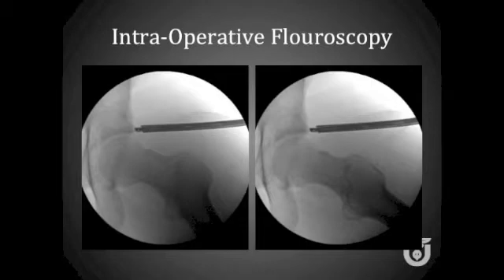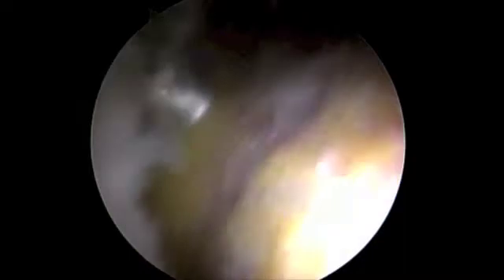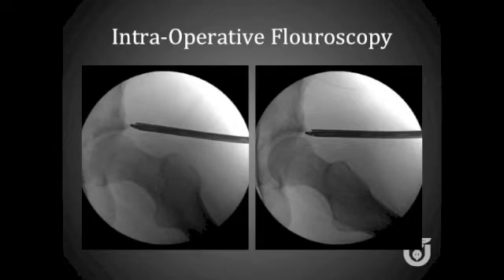Intraoperative fluoroscopy can be helpful as a second check to evaluate the depth of resection. Once happy with the rounding of the head-neck junction, the hip is once again flexed to relax the capsule and bring the femoral neck into view. This bone is planed down to restore the head-neck offset. Once the bulk of the bone has been removed, the burr can then be used on reverse to quickly buff the area of the resection to smooth down the edges. Intraoperative fluoroscopy in multiple planes is then used to confirm an adequate resection.